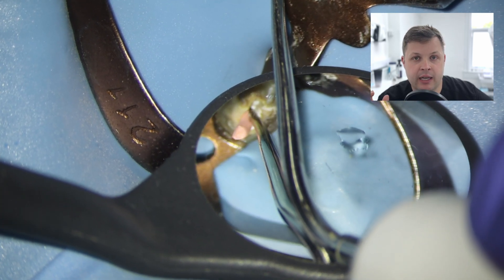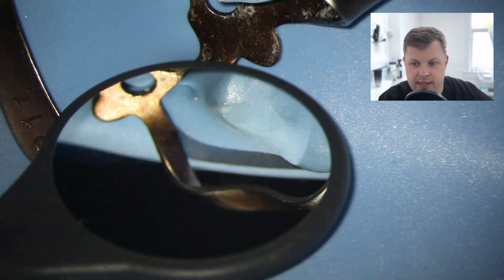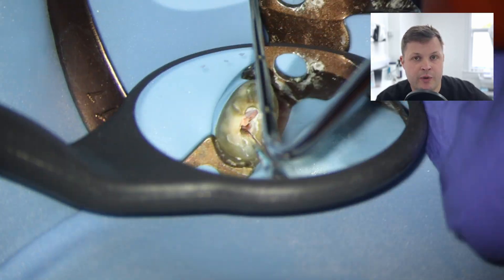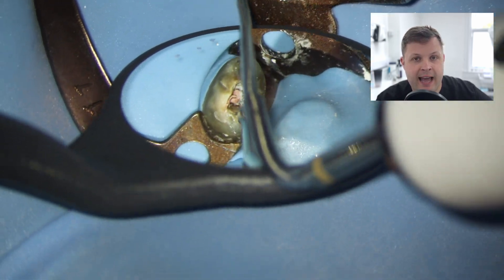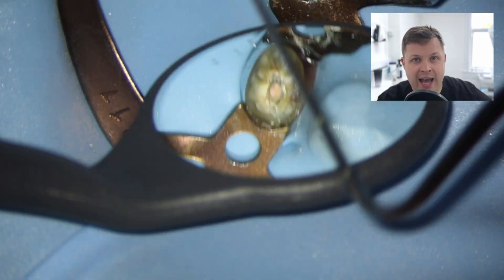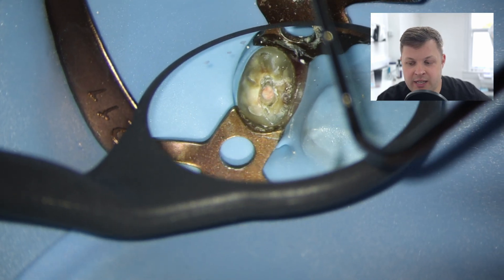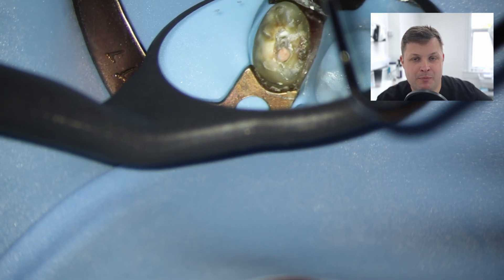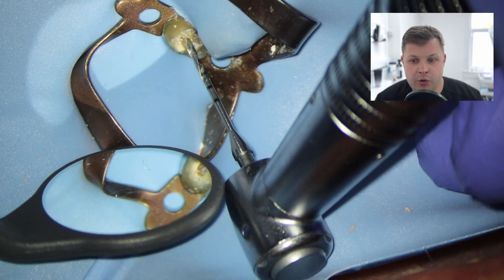I use a heated plugger to remove the excess GP and a Machtube plugger to condense things down. In this case, perfect condensation isn't critical because we're doing an immediate post placement. Some clinicians prefer to obturate and place the post at the next visit since placing a post into wet obturation can be tricky, but here I have the rubber dam on, the root canal completed, and I know the canal orientation — so I'm placing the post straight away. I'm using the Para Post system.